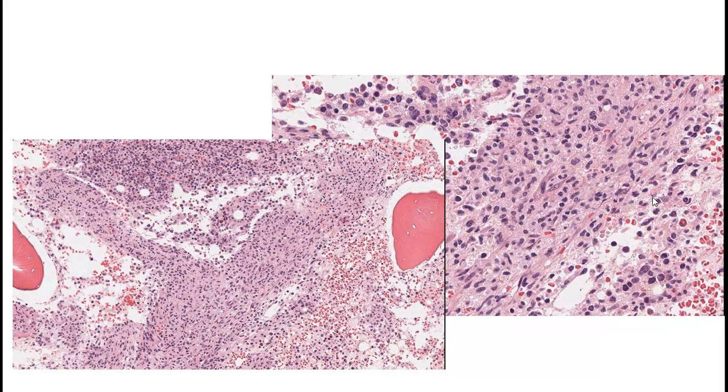When you look at the biopsy itself, for those who are not familiar with looking at biopsy, generally we don't look at the biopsy with high power. We look at biopsy with low power. In this case, this slide is about 4 times 4 times 4 times 5, about times 10. You don't look at the cellular detail in a biopsy. Rather, you look at the change in patterns.